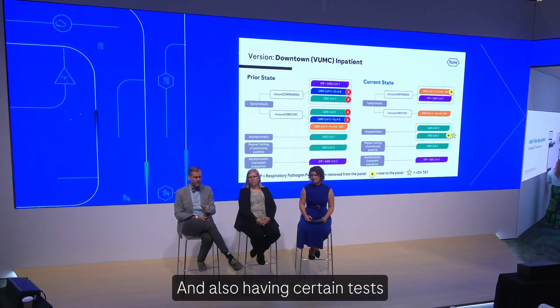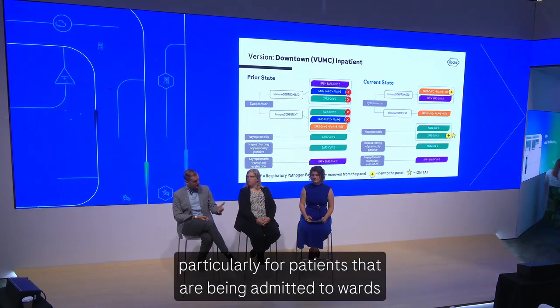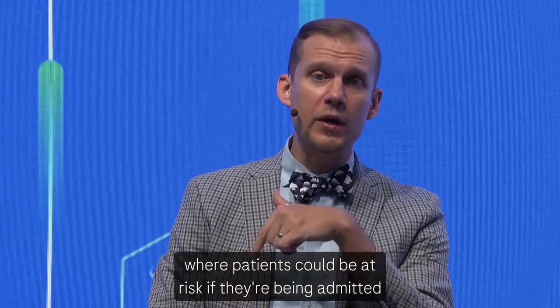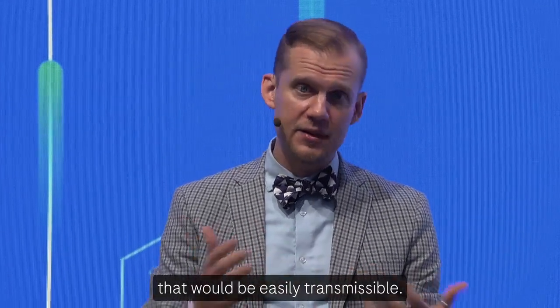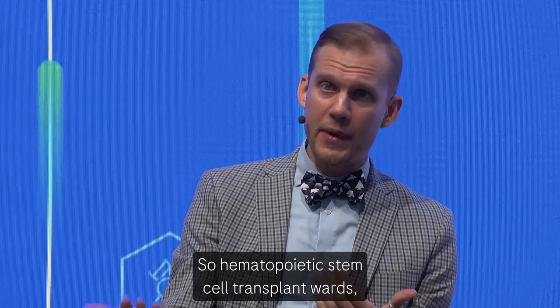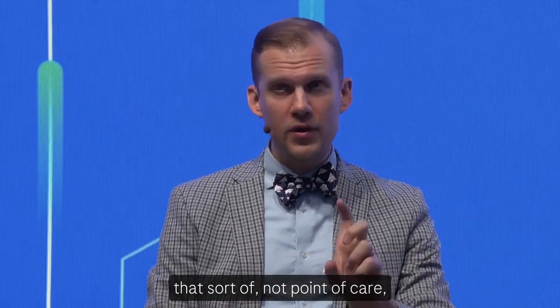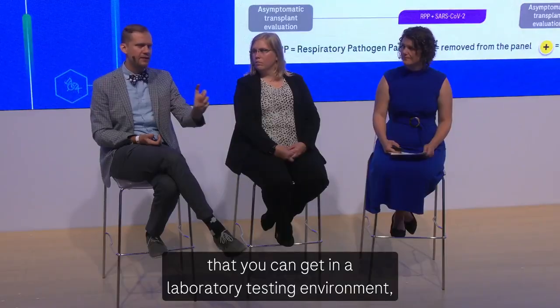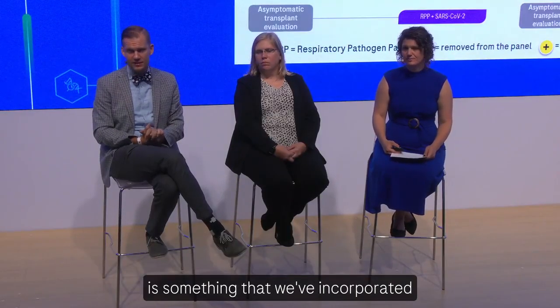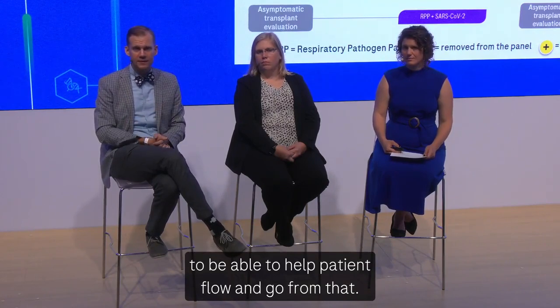And also having certain tests that have a much faster turnaround time, particularly for patients being admitted to wards with negative pressure rooms, where patients could be at risk if they're being admitted and have a respiratory virus that would be easily transmissible. So hematopoietic stem cell transplant wards, that sort of not point of care, but almost as close a point of care as you can get in a laboratory testing environment, is something that we've incorporated to help patient flow.